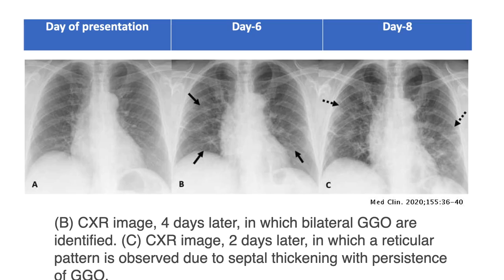The X-ray shows progression of disease on the day of presentation, day 6, and day 8. In image B, ground glass opacities are mildly developed — however, they are much more clearly visible on CT scan. On day 8 we see septal thickening with persistence of ground glass opacities.